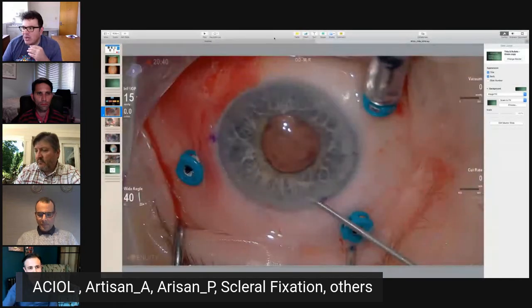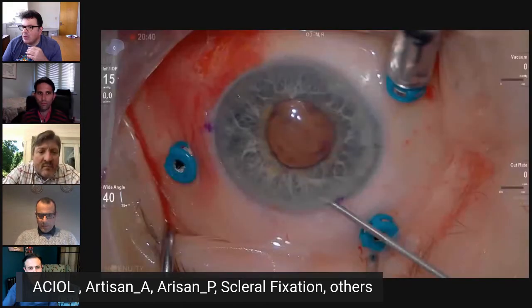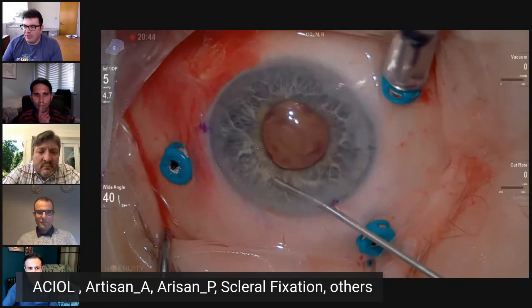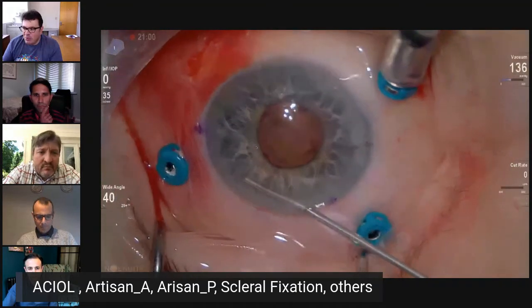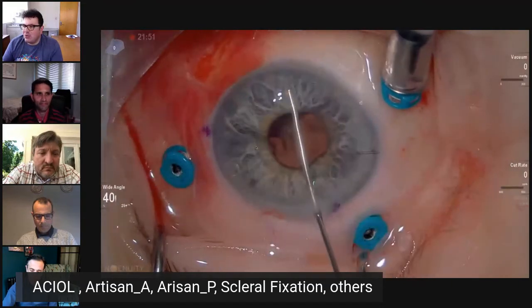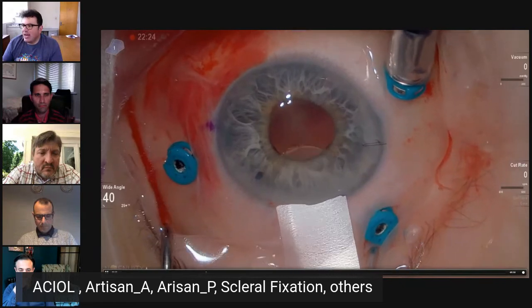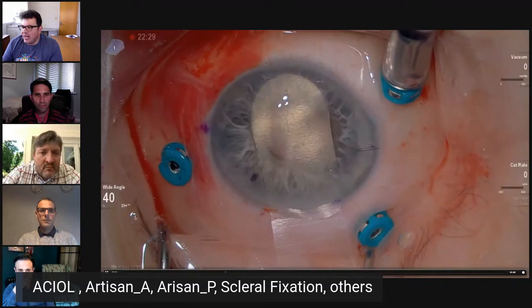So to start, I'll show here the technique of anterior chamber IOL. Very, very important not to forget to do the peripheral iridectomy in anterior chamber IOL. So always ask someone, the fellow or the nurse or the scrub tech, to remind you to do it. Then you want to use viscoelastic to protect the cornea. And then I tend to use a glide and make sure that the glide is not picking up the iris as you go into the angle, as you can see here.